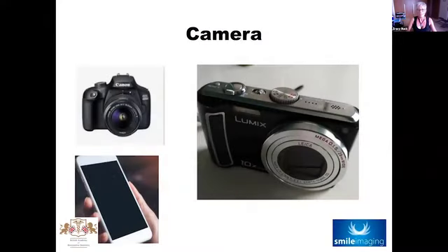So we're often asked which is the best type of camera to use for imaging. Although many of you probably already own an SLR camera, that's not actually required for imaging, okay? All we need for the quality of photo we require is a good point and press camera like this that you can see. Always take your photos with the flash on.